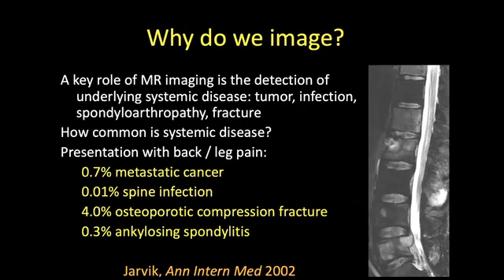So in terms of imaging, a technique like MRI is really exquisite for detecting these red flag conditions. So looking at some of the underlying diseases such as tumor, infection, spondyloarthritis, fracture. However, these are not the most common conditions.